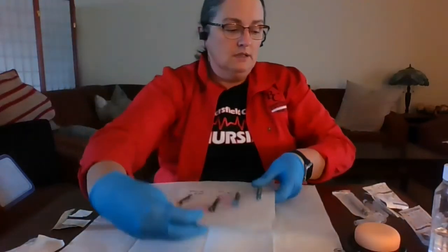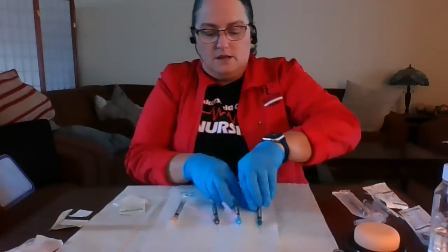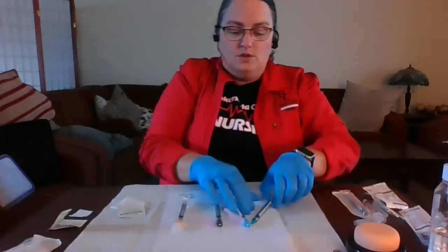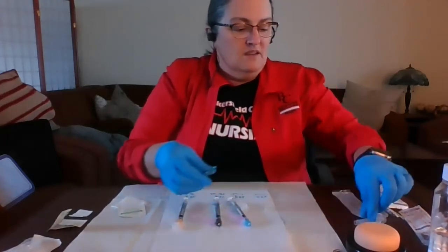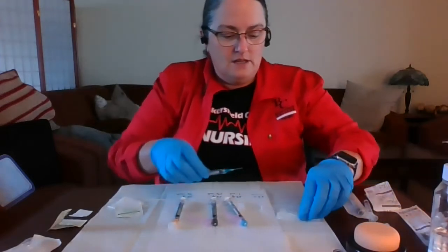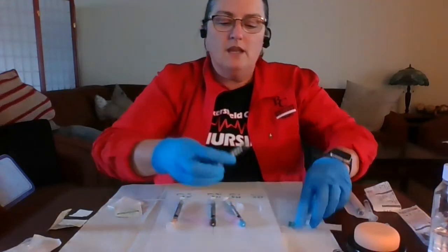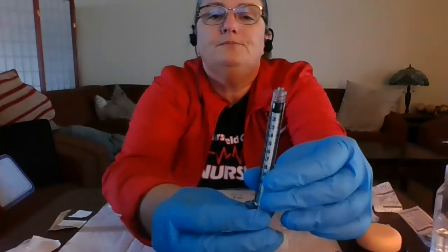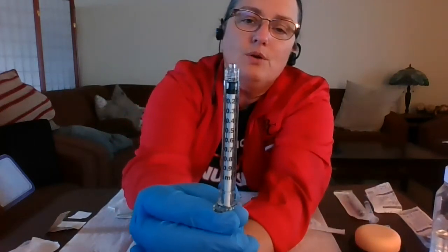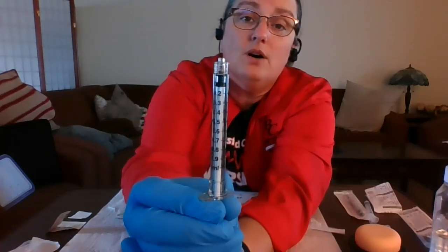And we're going to talk a little bit about the markings on the actual syringe. Again, I'm going to use my safety method of scooping into this needle so that I can remove it. When I'm talking about the markings here, I want you to see that this is a 1 ml syringe, and it's broken up into 0.1, 0.2, 0.3, 0.4, 0.5, all the way down.